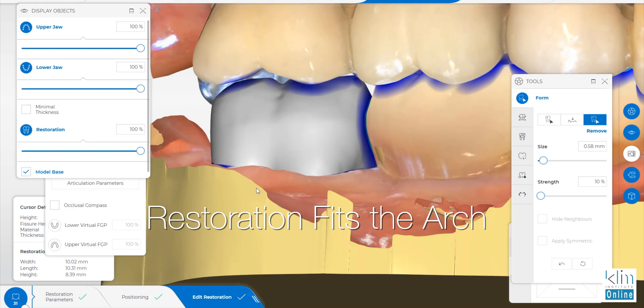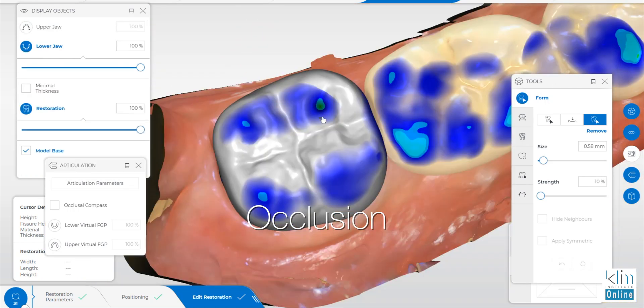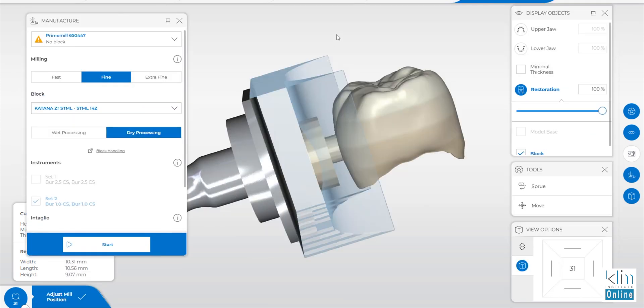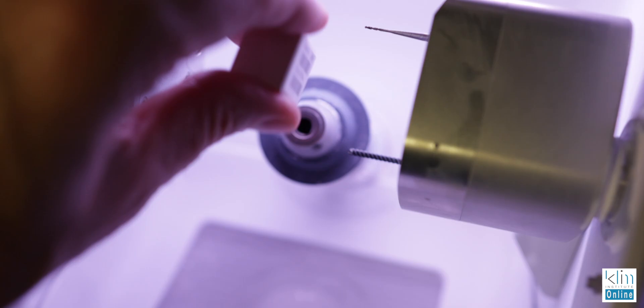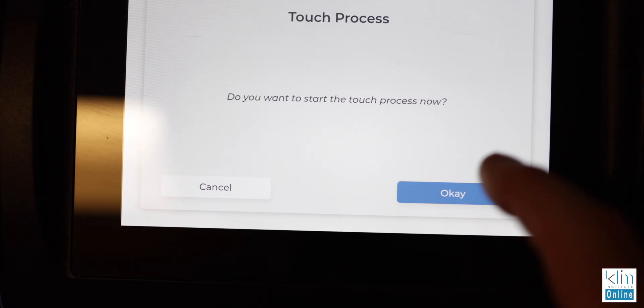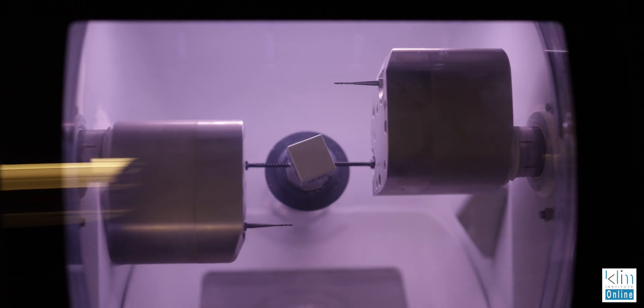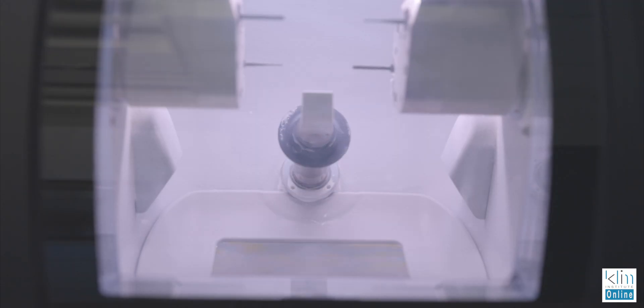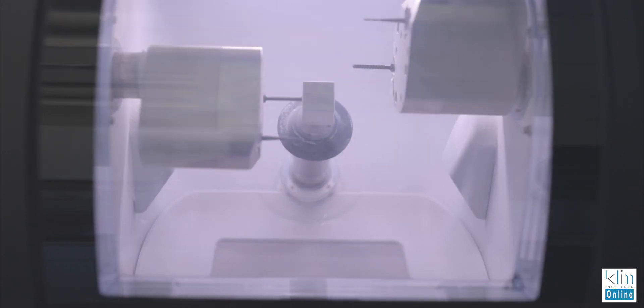Get the occlusion the way we want it, finish the interproximal, and then off it goes to the milling unit. I love the Prime Mill because you can set up the block where it does the pre-touch, so once you hit mill in the manufacturer screen you'll hear that vacuum come on and we're machining without any delays of the burs calibrating and touching.